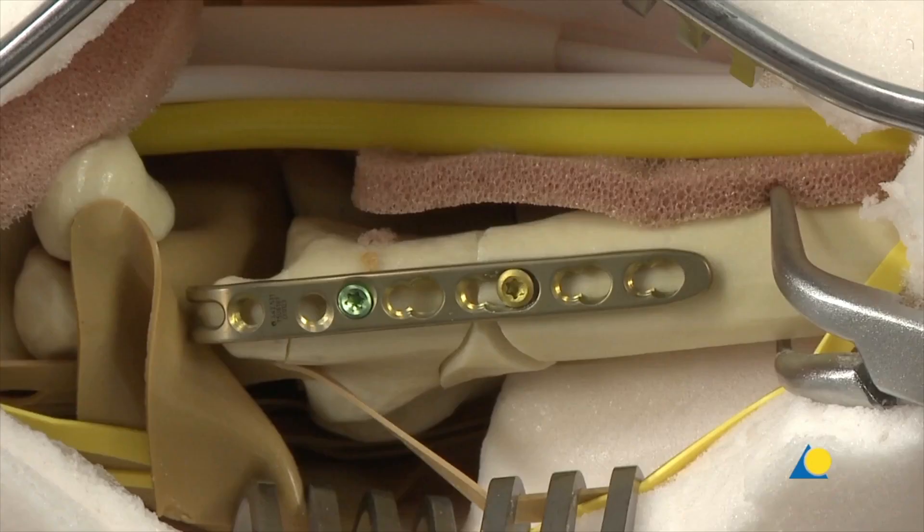The comminution zone is now bridged with the plate. Any fragments in this zone are left with their soft tissue attachments and are not fixed, to promote healing. At this stage it is important to check the reduction and the placement of the plate under image intensification before continuing with plate fixation.